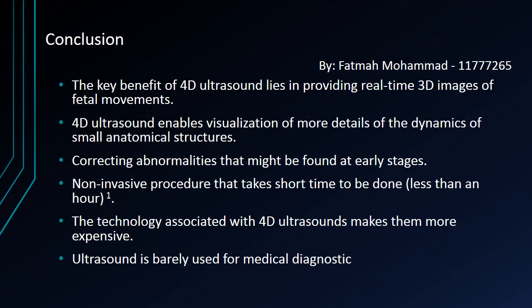So, in summary, 4D or four-dimensional scans build on the technology of 3D scans. The extra dimension is time, so effectively 4D ultrasounds are moving images of the baby in real time, as the baby kicks, moves, frowns, grimaces, sucks their thumb, opens their eyes, and moves their lips. These movements can be seen on the scan as they are actually happening.